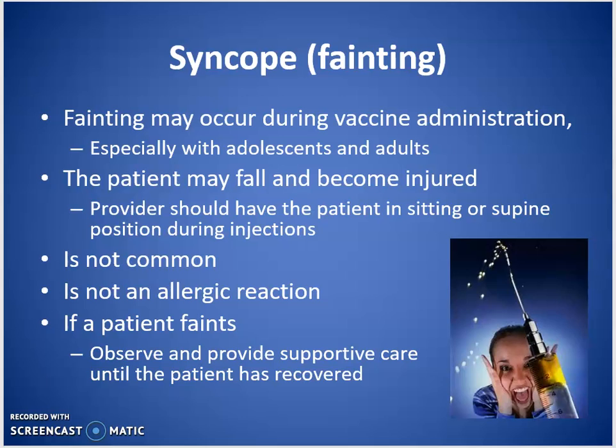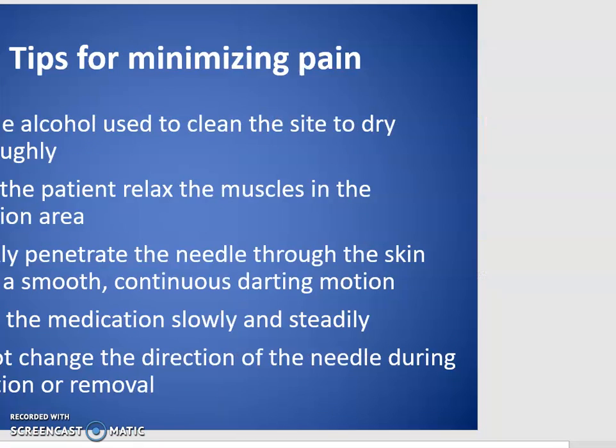If you have assistance, of course, that's always helpful. You may be on your own. But if that happens, you want to make sure they land as gently as possible and get help as soon as possible. And by the way, follow the protocol that your clinic has instructed you to follow in these types of situations. Always follow protocol.